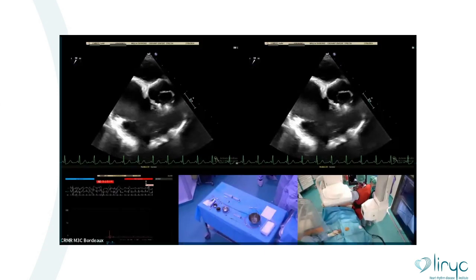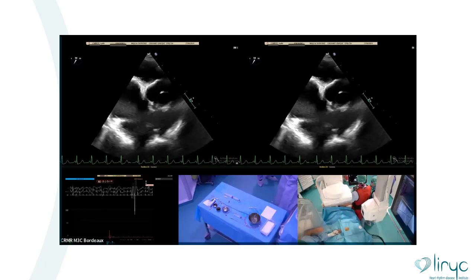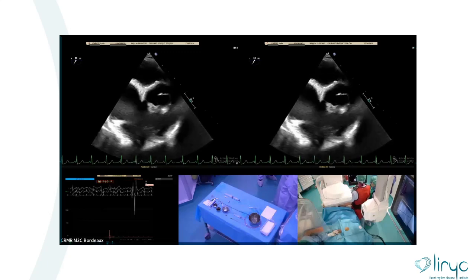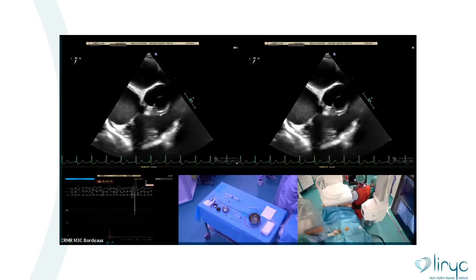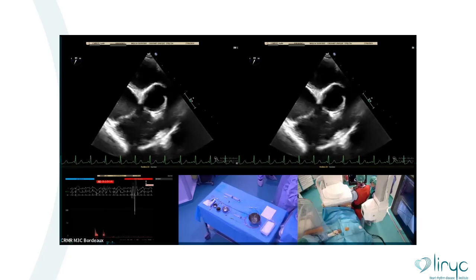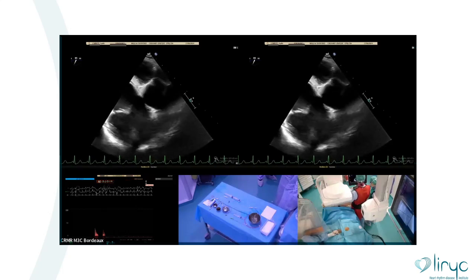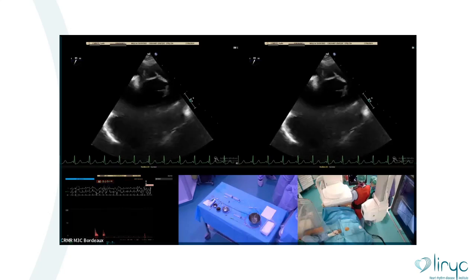Yeah, it's a very important comment, Mark. You are right. We discussed that yesterday, about some limitations of echo. You talk about kind of spatial resolution, even if it's not the spatial resolution, it's the elevation. So the fact that in one frame, we could see different types of structures. And you are right, sometimes we could either overestimate or underestimate the distance between two structures due to this inherent limitation.